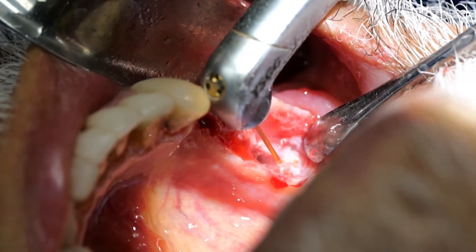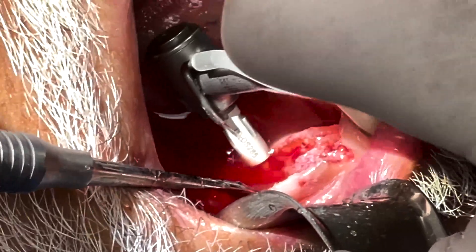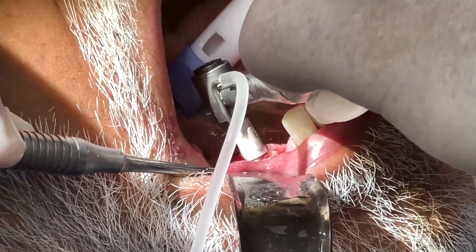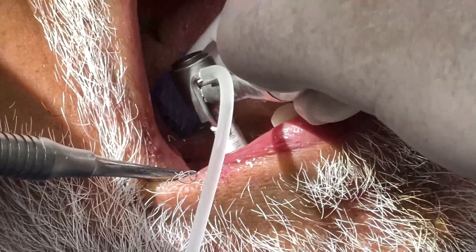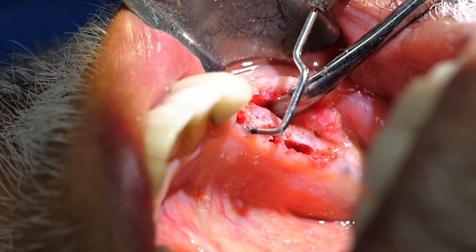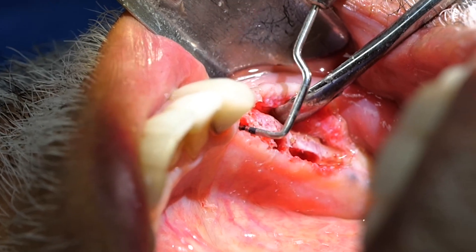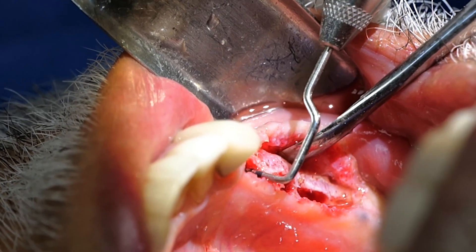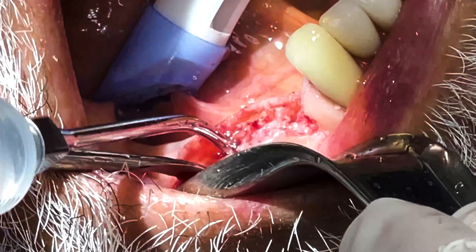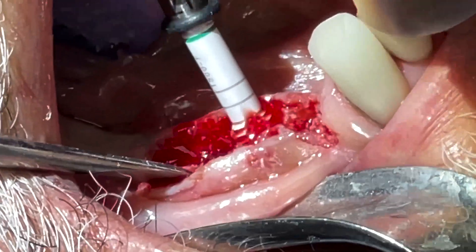After alterations are made and the final depth is achieved, I progress with the zirconia burrs to the correct diameter, always using the stops. At this point the speed is reduced to 200 rpm and throughout the steps I frequently probe or sound the walls and floor of the osteotomy to detect possible perforations sideways or proximity to the vital nerve. I use ozonated sterile saline for frequent irrigations between each step. The bone tapping is carried out at 20 rpm.